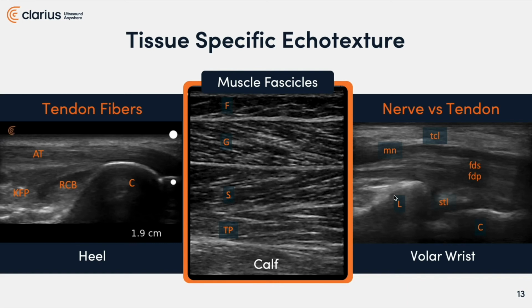And then lastly, as a reminder, this is long strand collagen of the flexor tendons at the wrist, covered by the darker fascicular structures of a nerve. And this white area here is the transcarpal ligament that makes up the carpal tunnel. This is the lunate bone and the capitate. Again, you remember these echoes of bone.